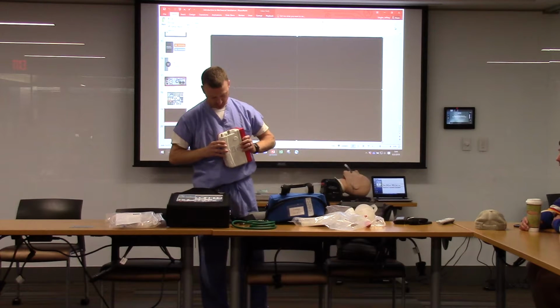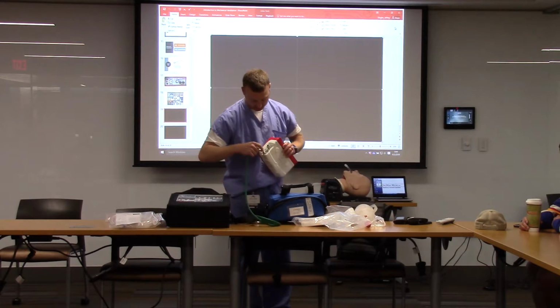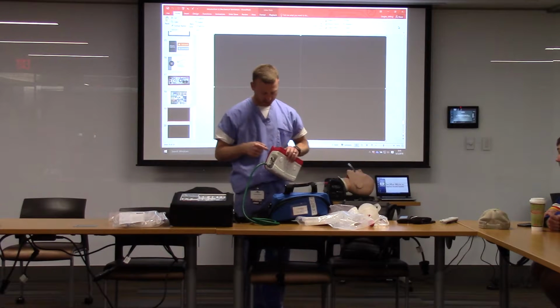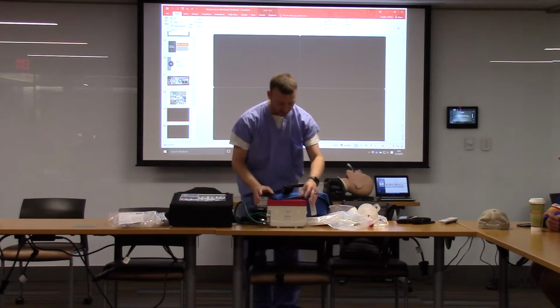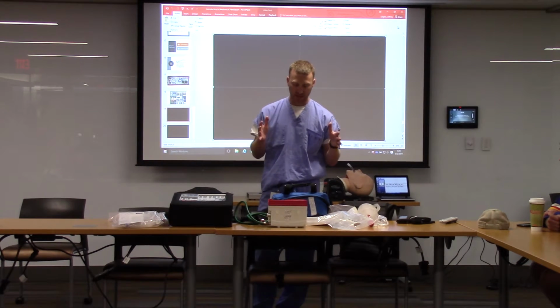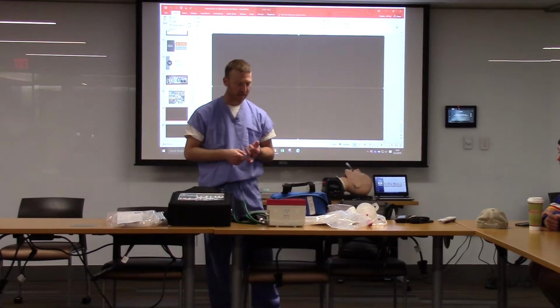Okay, so this one we need a tank to draw. It requires pressure from an oxygen tank to deliver gas, but basically you want to see what the patient's at already, and then you want a goal of pulse ox between 88 and 95%.